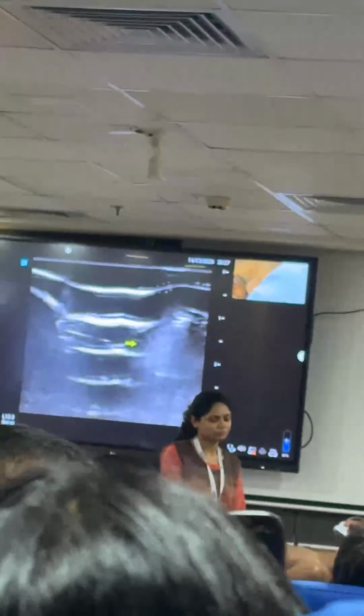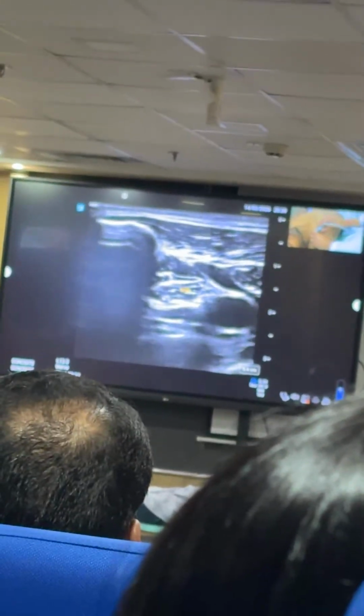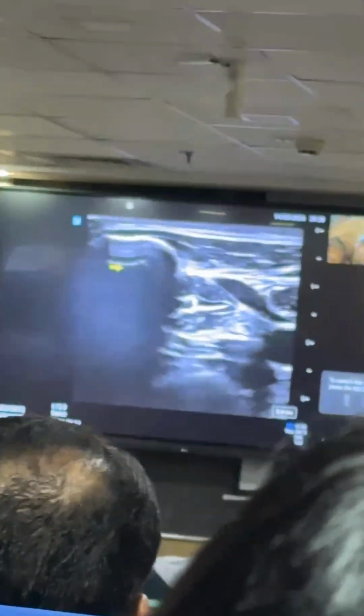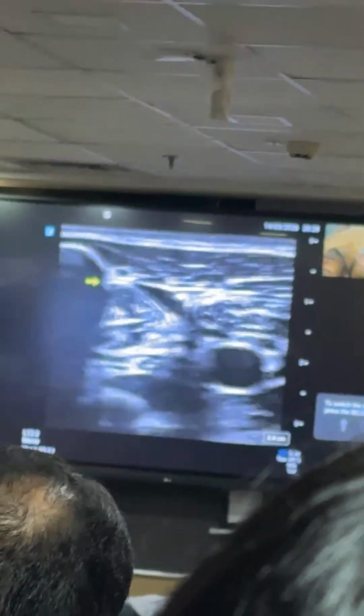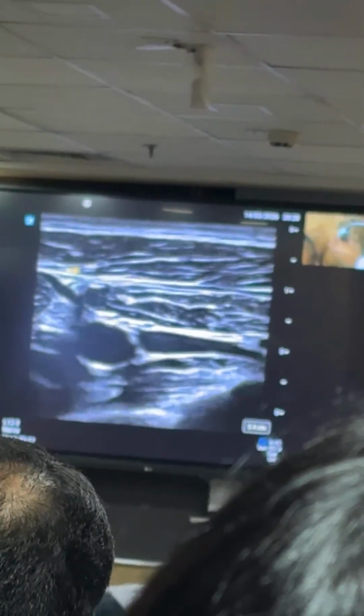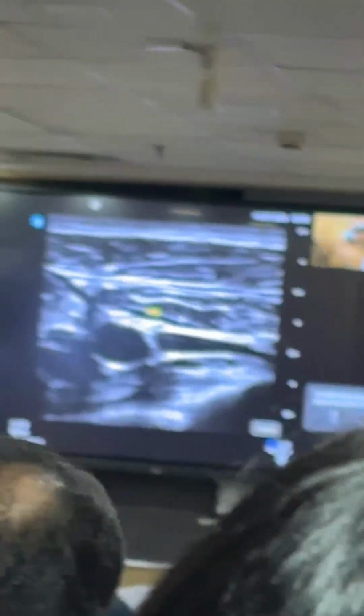The machine is there, so my needle is coming from cranial to caudal and I am seeing from here. Okay, so I am just starting my probe over here. I start with the clavicle. This acoustic shadow is this clavicle. If I am coming down, now I can see two muscle bellies, basically. One is pec major and the other is pec minor.